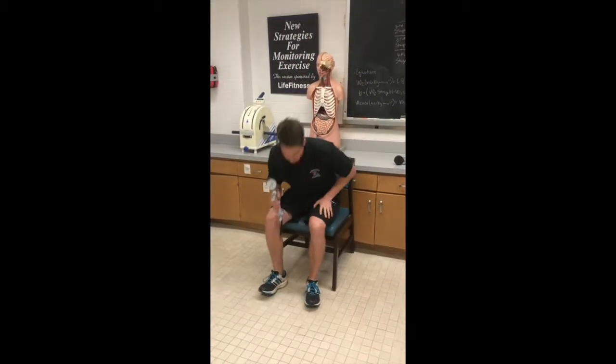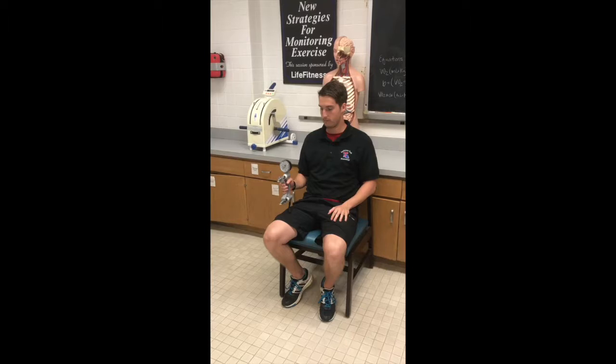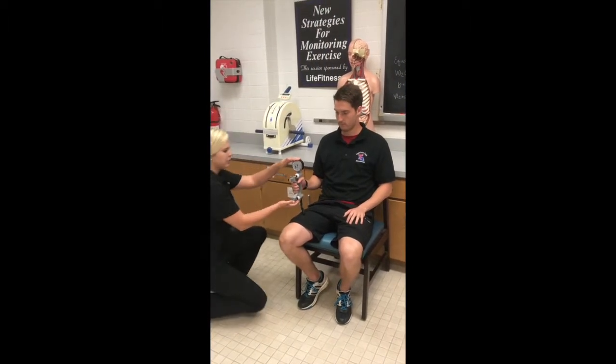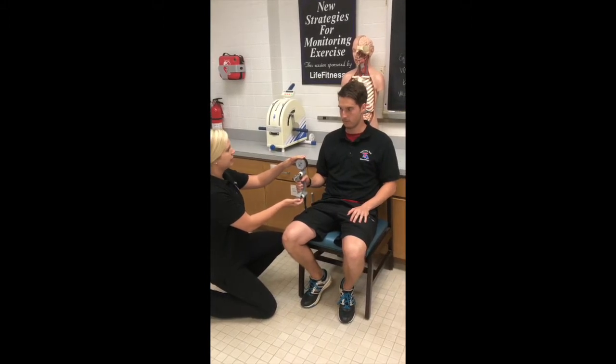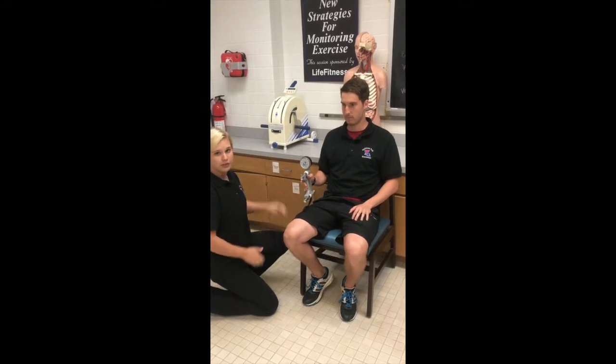Now he'll perform at 90 degrees. This part of the protocol is seated. He'll have his dynamometer at 90 degrees. I'll come in and hold it warm and steady so he doesn't have to steady it himself. I'll say, 'Are you ready?' and cue — 'Harder, harder, relax.' We'll record this value.